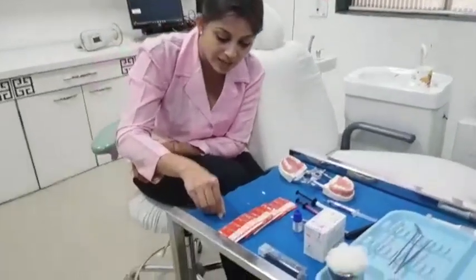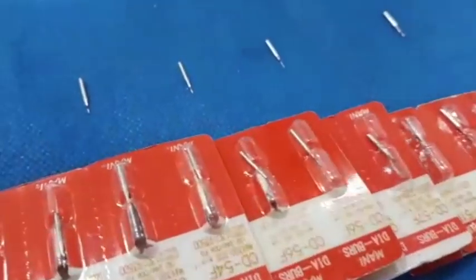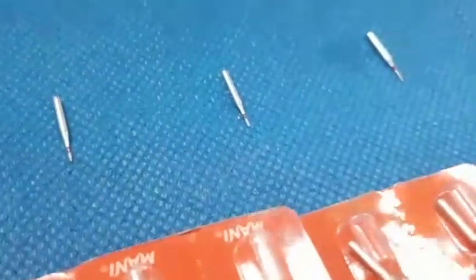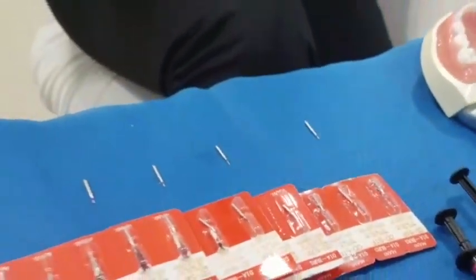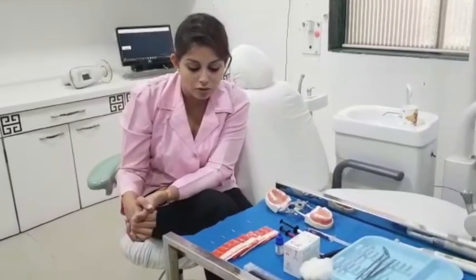If you could focus on the heads of the fissurotomy burrs, viewers would get a better idea of how sharp they are. Now there are different types of grooves or fissures: U-type, V-type, I-type, IK-type. But these cannot be seen with the naked eye — you will have to do SEM photography and only then you can understand the shape of these grooves.